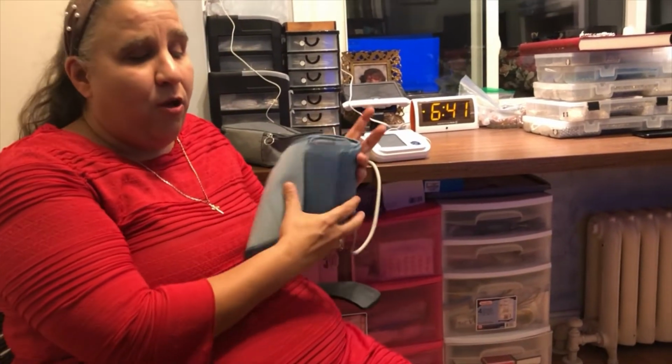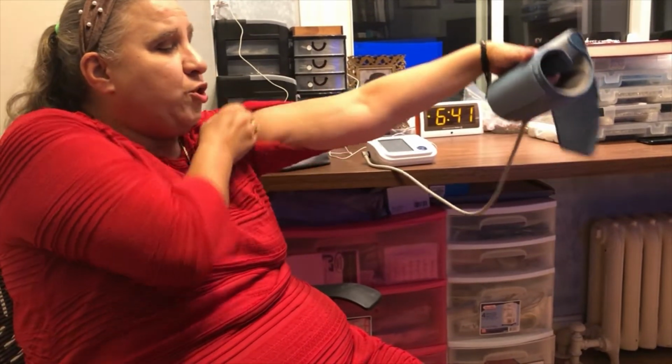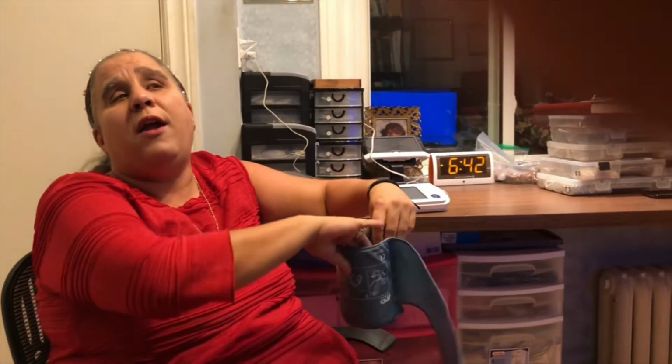So let's say I'm on my own. I'm not feeling well. Nobody's home. Can I do this on my own? Of course I can. I should have worn another shirt because this one's got tight sleeves, but I've opened up the cuff. Now this is a medium cuff, and it's good for my mother. It's good for my cameraman. For me and my husband, it's a little tight, but it still does the job. But if you're a person who's a little bit overweight, maybe get one where the cuff is the large cuff. If you're bone rack thin, then get the one that's small.